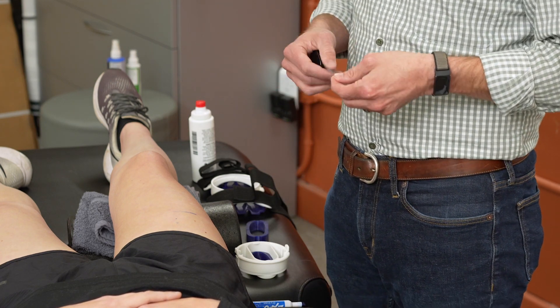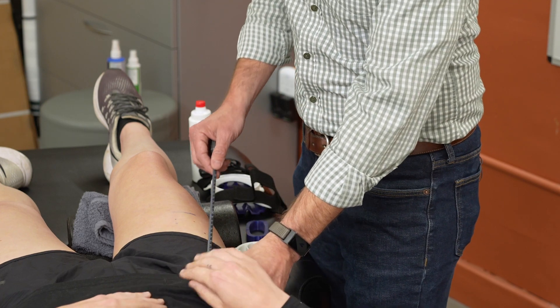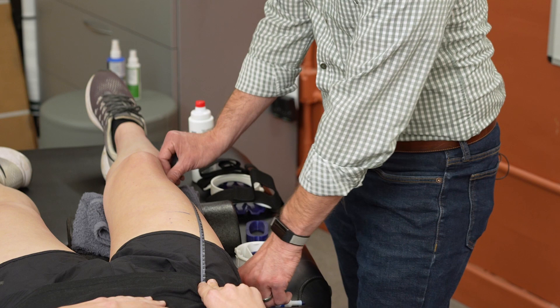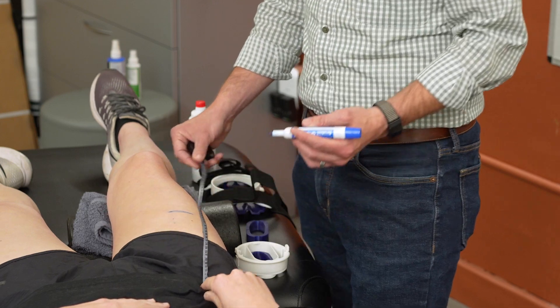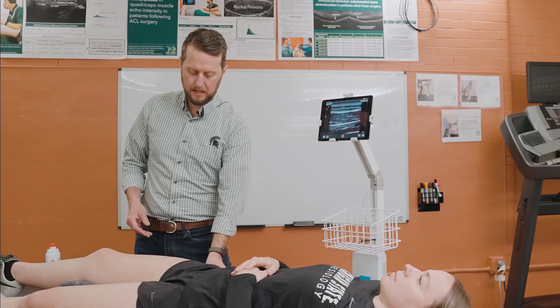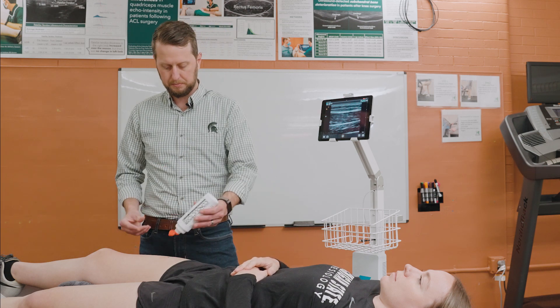To start this assessment, we are going to measure the participant's leg length from the ASIS to the lateral joint line. Then once we have that leg length assessment, marking the 50% mark between those two locations. We're doing that so that we're able to standardize where on the leg that we're assessing the muscle between participants.